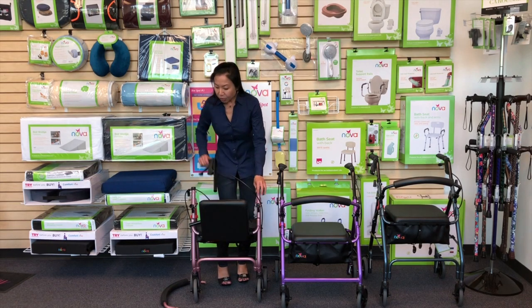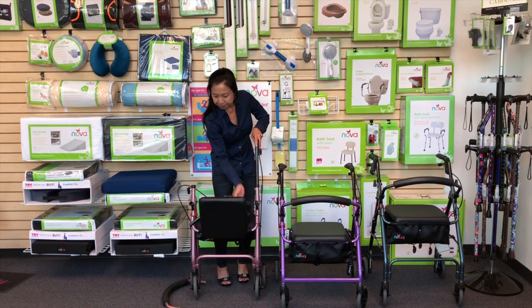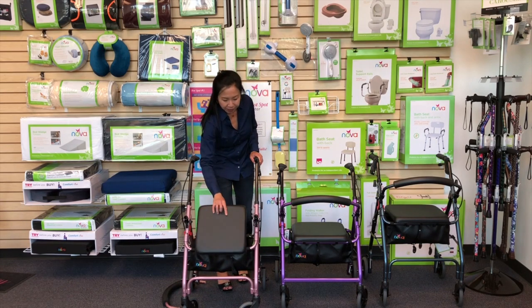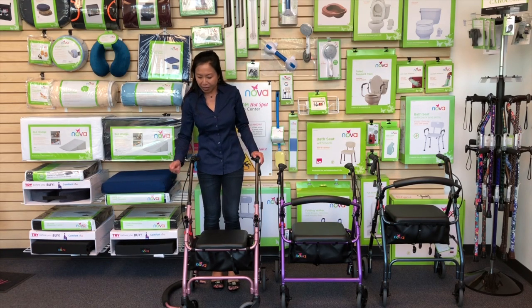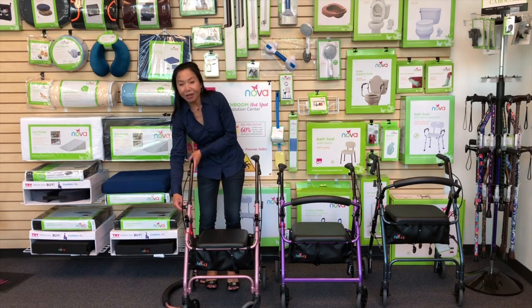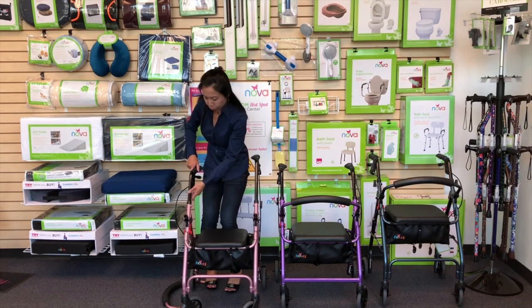They're just for protection. Go ahead and remove them, and then you're just going to discard them. All right? Go ahead and insert the handles into the frame, and then give the walker the brakes a squeeze, and that will open up the walker. All right, so now I'm going to show you how to adjust the handles to your desired height. The adjustment knobs are already inserted through here, and that's for safekeeping. So you're going to go ahead and unthread them, and then adjust the handle to your height.